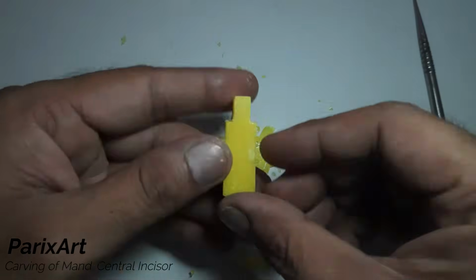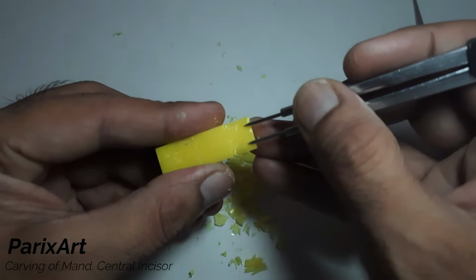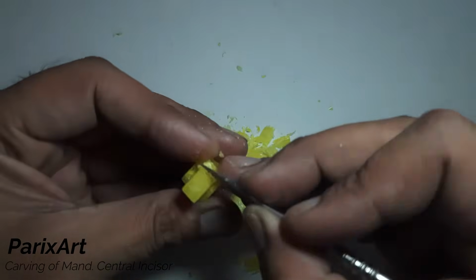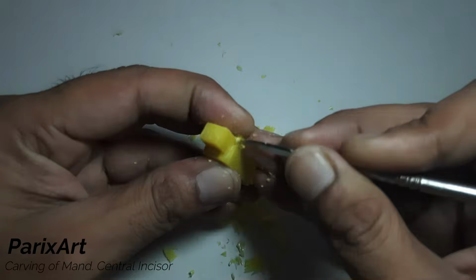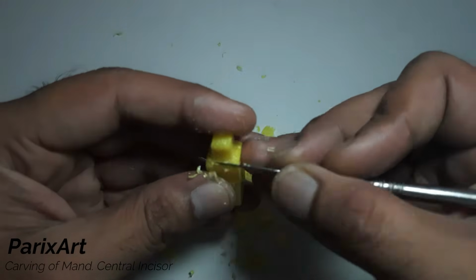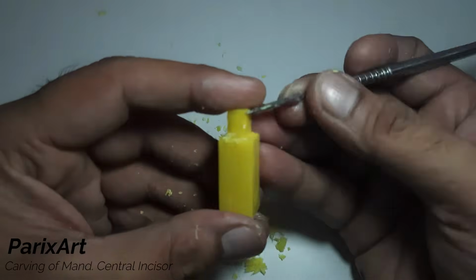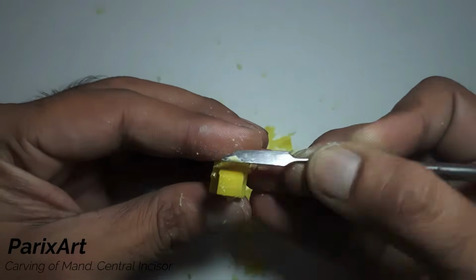Mark the labio-lingual width of the crown, that is 6 mm, but we'll take a little extra, about 6.5 mm. Now we'll cut it straight down to the marking of the crown length to make a cuboid. Make straight parallel walls within the marked dimensions and keep verifying the required dimensions.